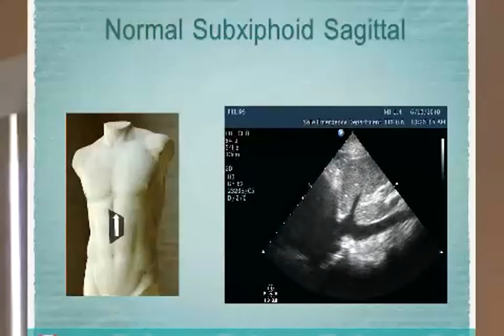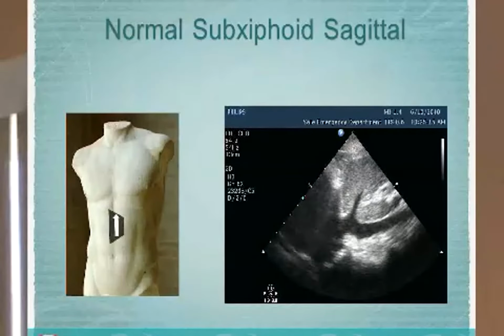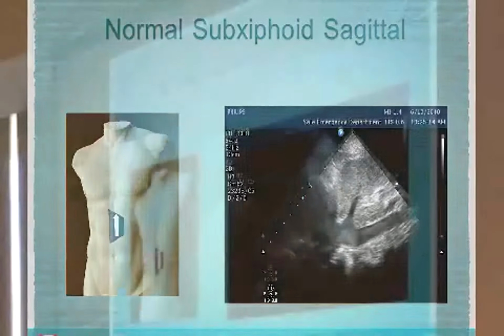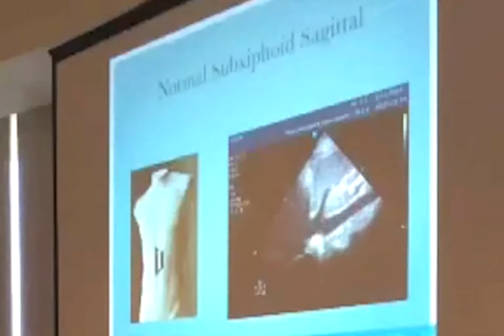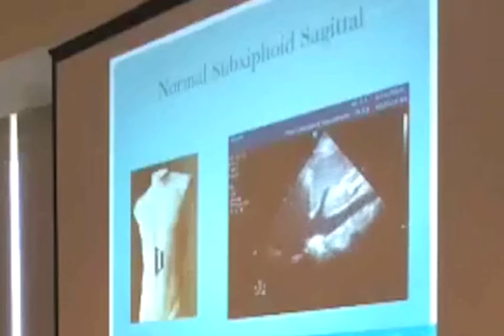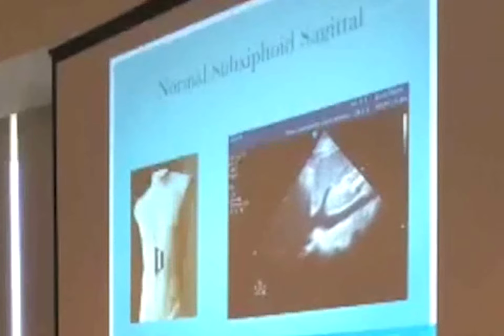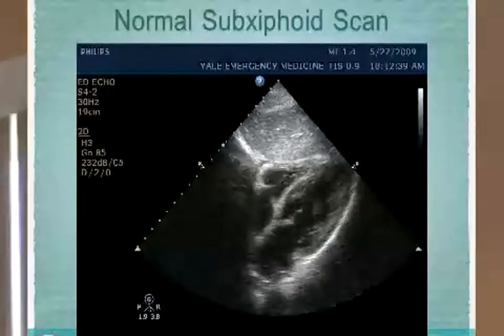We talked, in the groups that rotated with me, about an easy way to go from the subxiphoid view, rotating into the sagittal plane, going left and right a bit to see your IVC. This is the sagittal view of the IVC. You can see the hepatic vein dumping right into the IVC, right below the diaphragm. You would use that, not necessarily as part of a FAST exam, but if you're resuscitating a patient and want to see if they're dry or wet, if you think they're going to end up being fluid responsive or not.